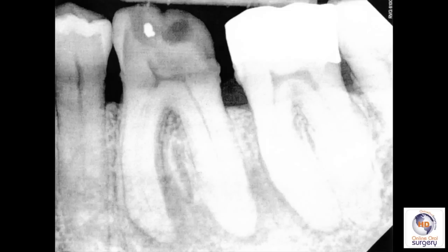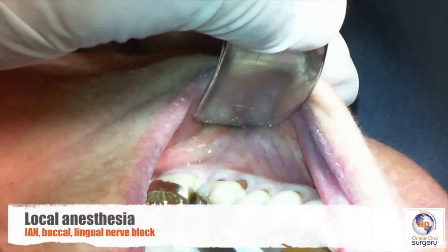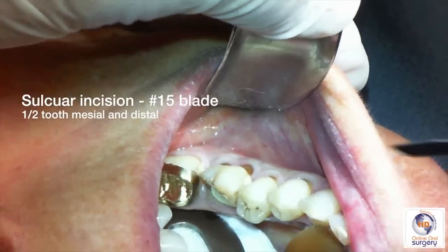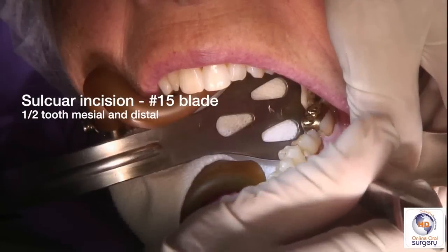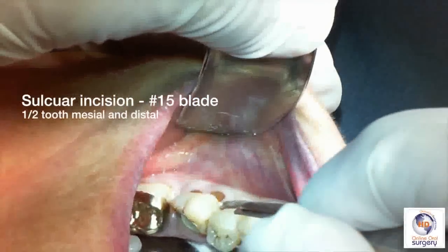Hopefully we'll be able to use a cowhorn forcep and lift this tooth out without it breaking. But because the tooth has decayed, there's always that possibility, and so in the back of our mind we're always going to be thinking ahead about what we're going to do if the tooth should break. So after you've given an inferior alveolar, buccal, and lingual nerve block, we're going to go ahead and make a sulcular incision.